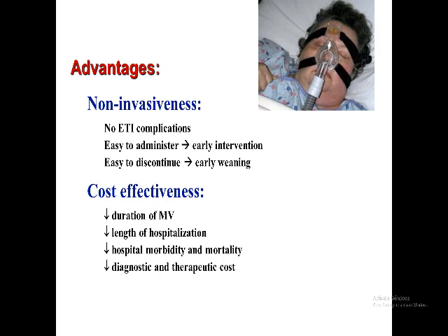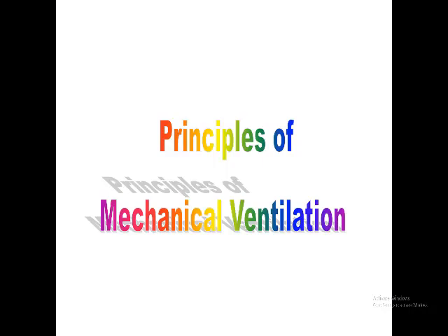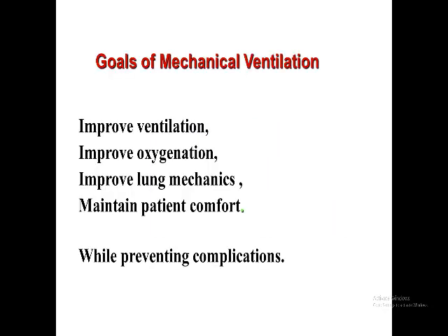Advantage of non-invasive ventilation is no endotracheal intubation, easy to administer, leading to early intervention, easy to discontinue, early weaning, cost effectiveness, decrease the duration of mechanical ventilation, decrease the length of hospitalization, decrease hospitalization morbidity and mortality, decrease the diagnostic and therapeutic cost.